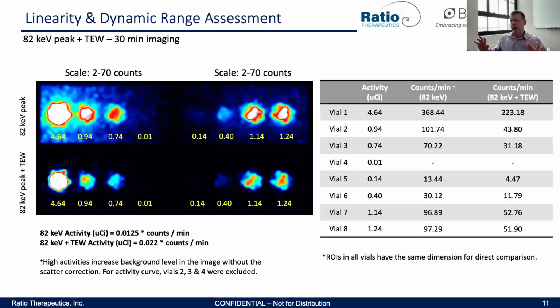So this also is now giving us a sense that a dedicated experiment to look at the lower limit of quantitation, which is on the docket but hasn't been done here, would be appropriate. But this starts to give us that understanding of, okay, what are we going to be able to see? What won't we be able to see? It starts to set those expectations, which can be hammered out in later experiments.